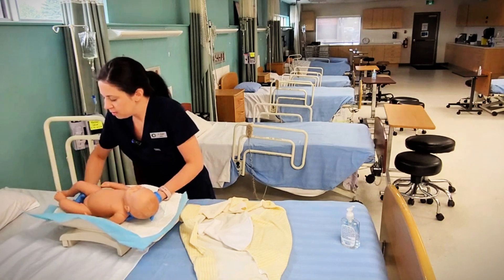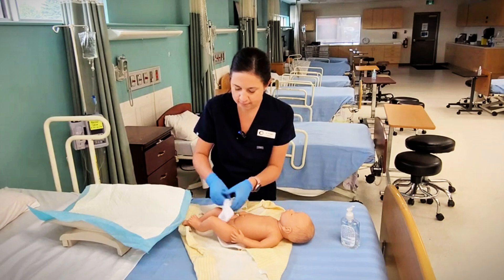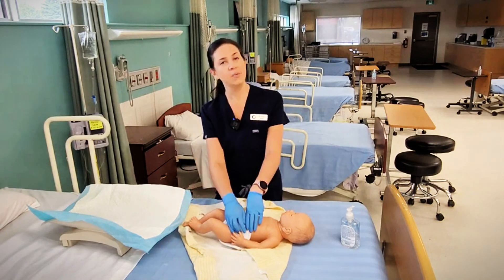I'm going to have a good grasp on my baby again, get baby dressed, and record our weights. That is how you weigh a baby.